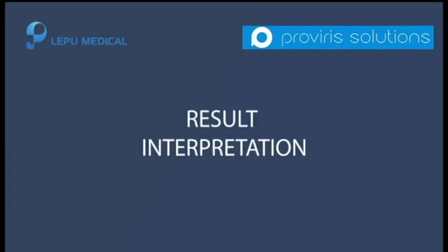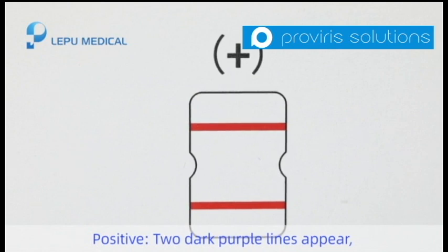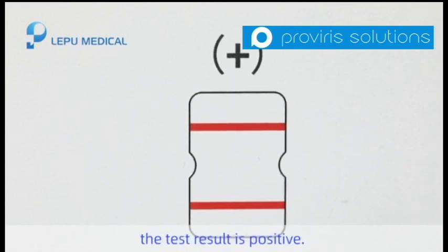Results interpretation. Positive: two dark purple lines appear. The test result is positive.